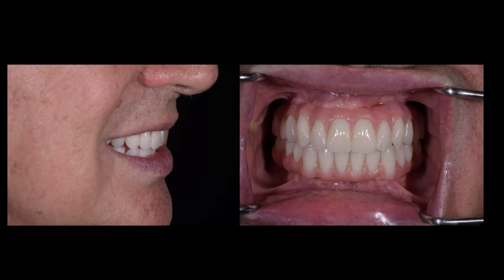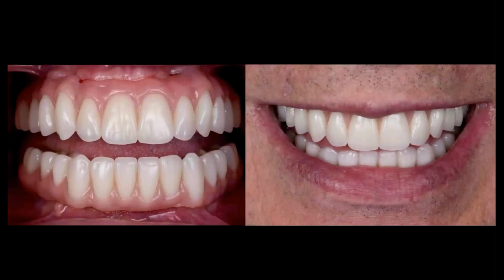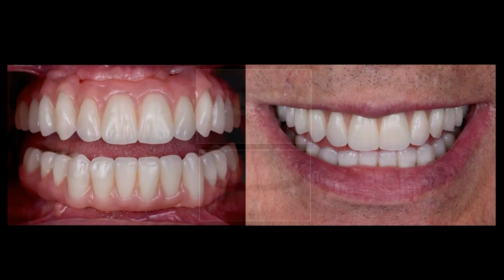So all the little things that we're trying to incorporate in there to make it look a little more natural in the flow of what he has. And in the end, we finalized him here. And what's interesting is he has a disruptive face, right? So we had to make sure that the midline followed the path that we wanted to, but we also wanted the plane to follow the disruption in his face.